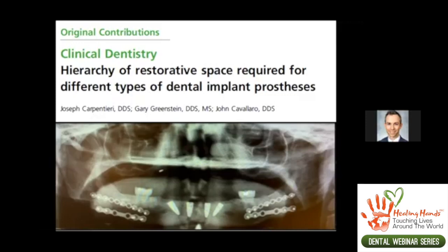And if you need the implants to be further apical for the vertical clearance, then you've got to look and plan this in 3D, based on 3D imaging, to see where the implants need to go. Do we have enough bone there? That's the key, really. And sometimes we may not be able to remove enough bone to create vertical clearance. In some of those cases, we're going to need to increase the vertical dimension of occlusion, because we don't want to create a situation where we turn somebody's mandible into a really vertically atrophic mandible either.